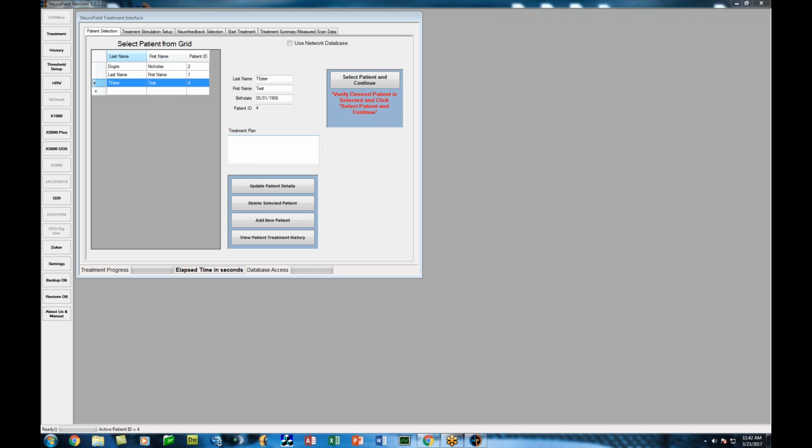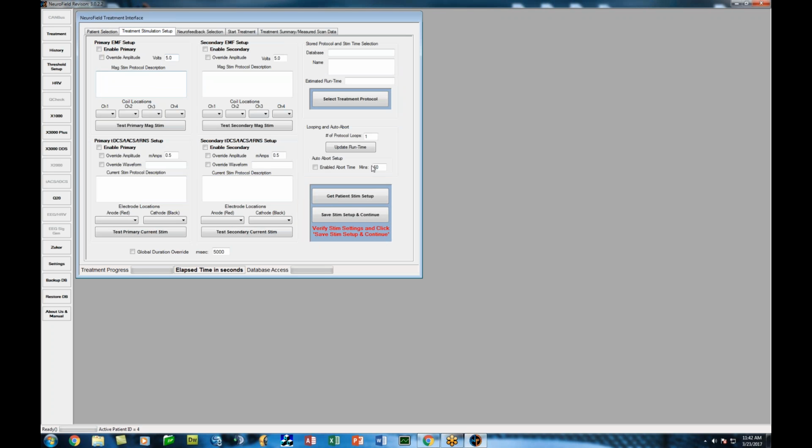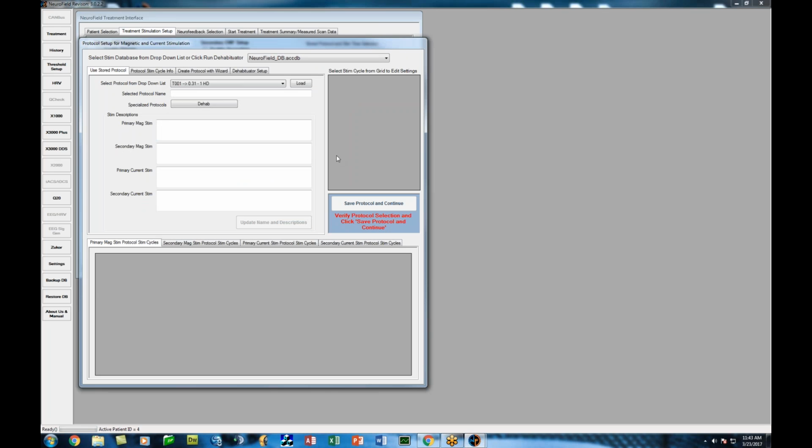There should be. Okay, here's another one for you. I'm going to take you guys through something real quick. I didn't touch on this while I had electrodes on Annie, but I should have, darn it. All right, here we go. For people that bailed out early, they're going to miss this one. You can do amplitude training in NeuroField.